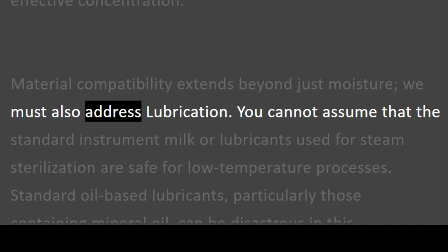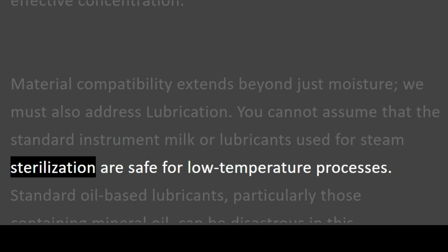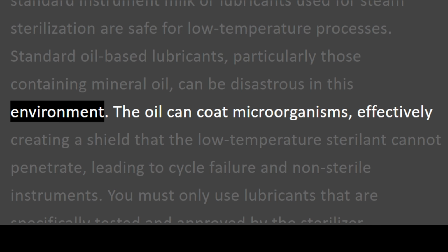Material compatibility extends beyond just moisture. We must also address lubrication. You cannot assume that the standard instrument milk or lubricants used for steam sterilization are safe for low-temperature processes. Standard oil-based lubricants, particularly those containing mineral oil, can be disastrous in this environment.